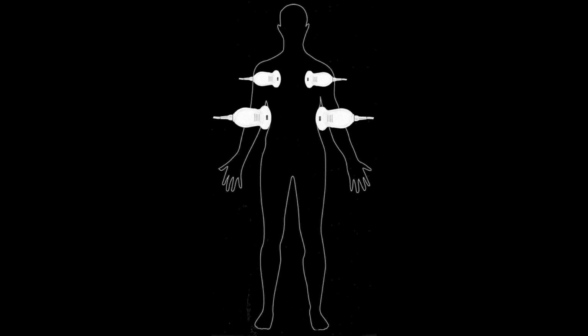So, with those assumptions aside, let's talk a little bit about the basic windows that we're looking for, right? There are a couple of basic zones. You can divide it up left and right, so the left side will be mirrored on the right side. But you want your posterior zones, right? The right upper quadrant window where you look up into the thorax is the posterior zone. And then your anterior zones, where you're looking along the parasternal line, a line that runs along the parasternal space anterior to the lung.